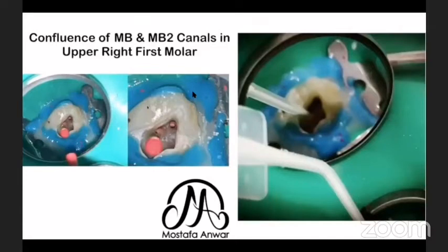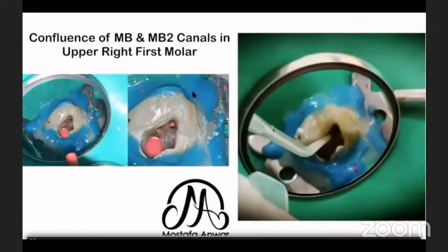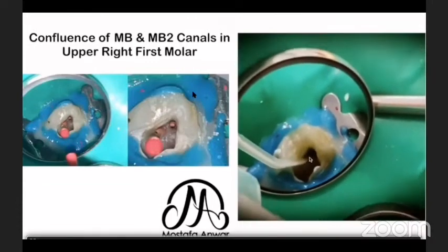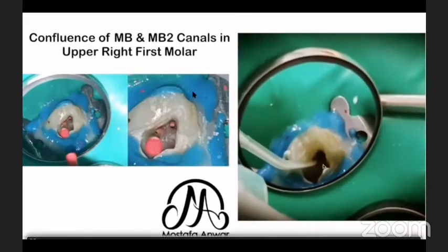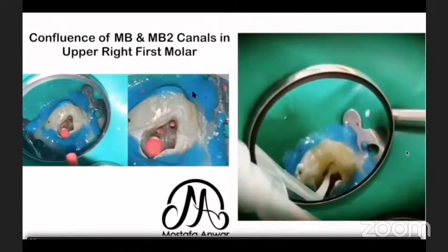In this case, I did troughing to find the MB2. After finding it, I proceeded with obturation. I placed the master cone inside the MB2 canal, and from the mesiobuccal orifice you can see they have confluence, sharing the same apical foramen. This was confirmed while injecting bioceramic sealer in the MB2 canal — you can see how beautifully the bioceramic sealer comes out of the mesiobuccal canal.